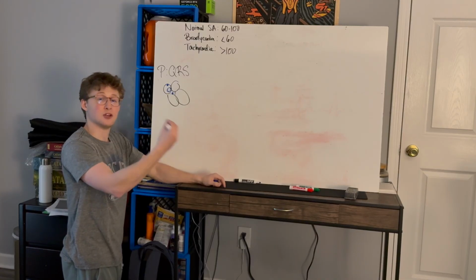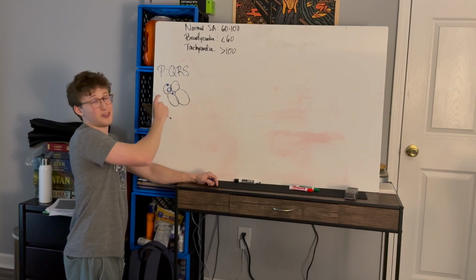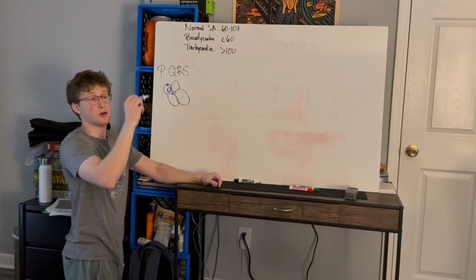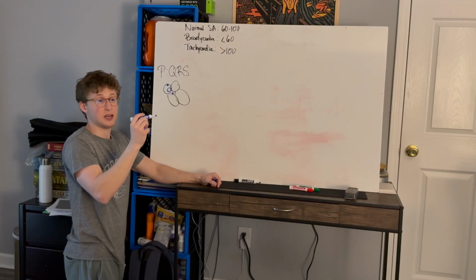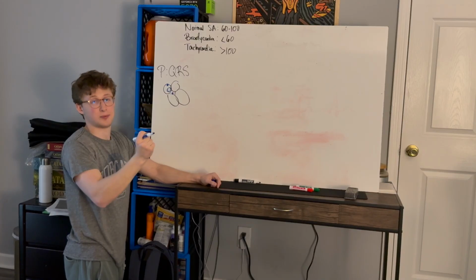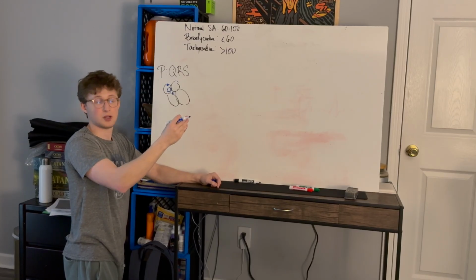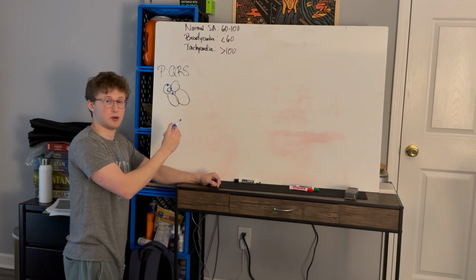So in atrial flutter, as an example, you can have this cycle of impulses causing the atria to depolarize in a coordinated way, but depolarize multiple times for each time that one of those impulses is allowed to go through the AV node into the ventricles. The other ones that are coming through are getting blocked by the AV node because it says, I'm tired, I'm still resetting from the last impulse. So you can see 2 to 1 or 3 to 1. 2 P waves for every QRS, 3 P waves for every QRS.